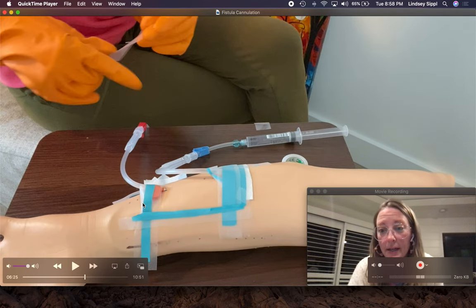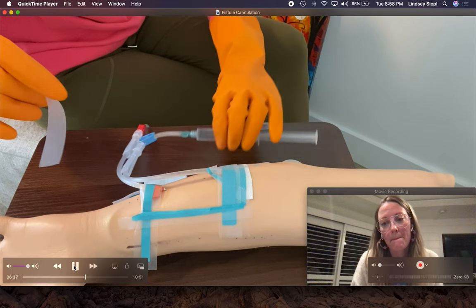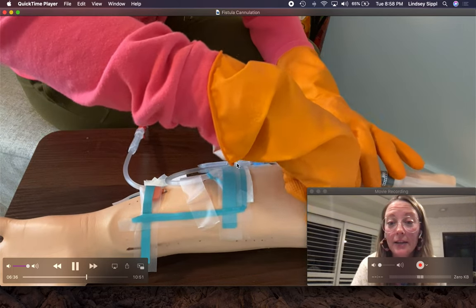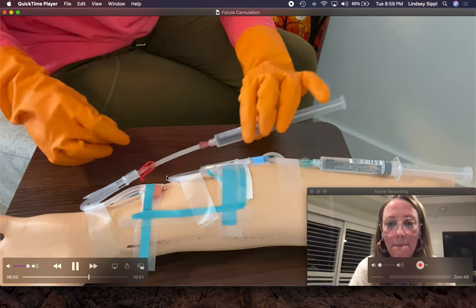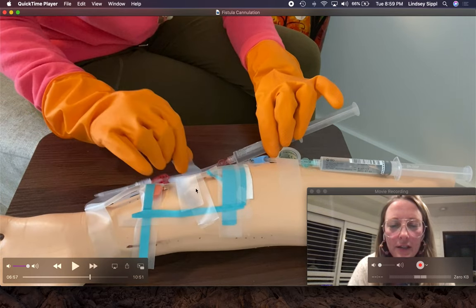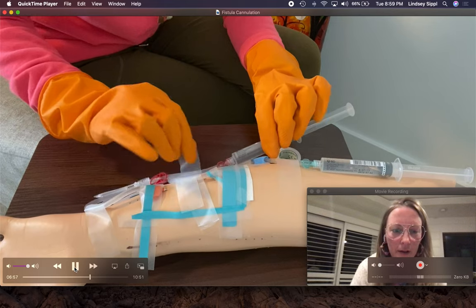Best practice is whenever you pull tape off the skin, you should get new tape, because the more you tape and de-tape, the less sticky it gets and the higher the risk of the needle falling out and the patient bleeding. Patient bleeding is a big deal — blood flow is at least 600 mLs per minute and can go up to 1800 mLs per minute. If that needle comes out unnoticed, they will lose a lot of blood very quickly. Secure taping is a very important part of dialysis. Also make sure there's a little bit of slack in the tubing, because patients sometimes move their arm and you don't want it pulling taut on the needles.